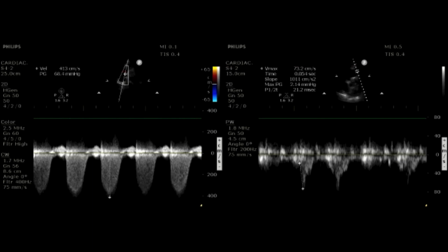We all feel that when you have a McConnell sign and the apical tethering is pulling the right ventricle upward, TAPSE is not really reflecting right ventricular free wall function. Right ventricular free wall function is actually artificially increased in these patients. So we don't find TAPSE that useful. There are many instances in which you find a TAPSE of 23 or 24 millimeters with a massive or submassive pulmonary embolism. So that's a word of caution. If TAPSE is not obtained properly, I would not recommend using it. And it's very difficult to obtain a TAPSE properly, even in the best of circumstances. There are lots of errors there.